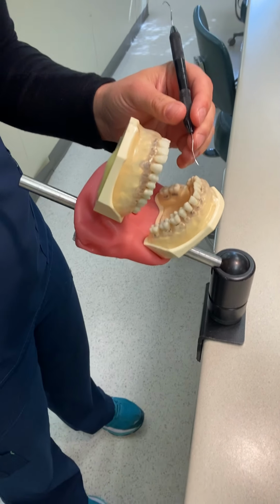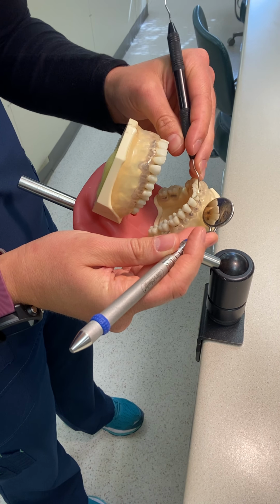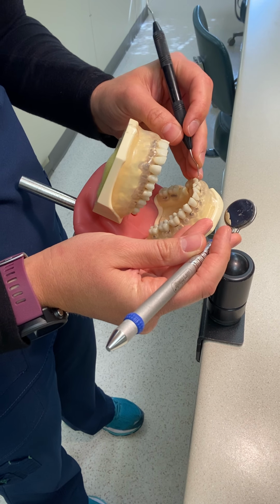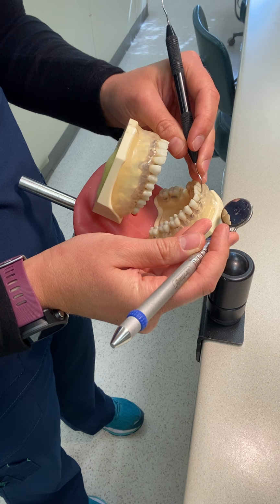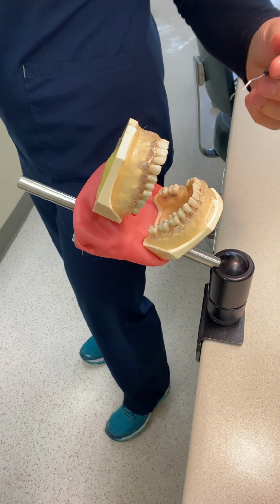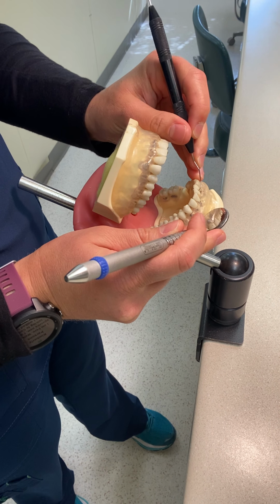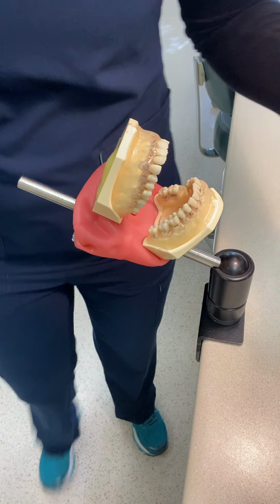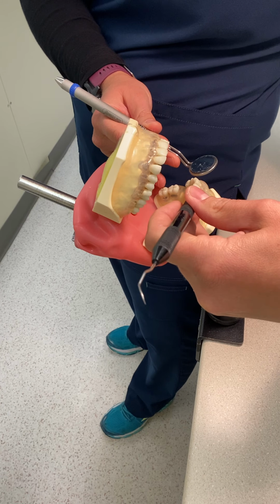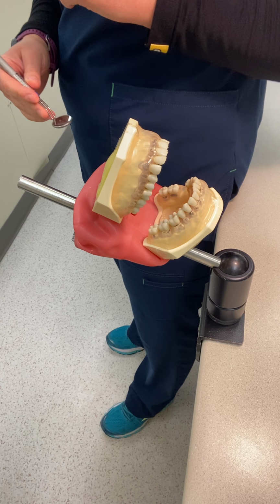I'm working on the sides that are going toward my non-dominant hand. Like I'm working toward my non-dominant hand rather than turning backwards. But now, let's say I'm going to switch to surfaces toward. So up here were my surfaces away. Down here are going to be my surfaces toward me. So I'm going to come down to my 4 or 3 o'clock position, and I'm going to work on the opposite sides of the teeth, working toward that non-dominant hand.